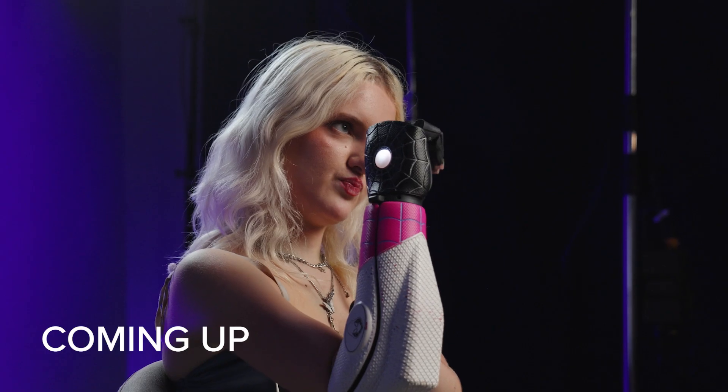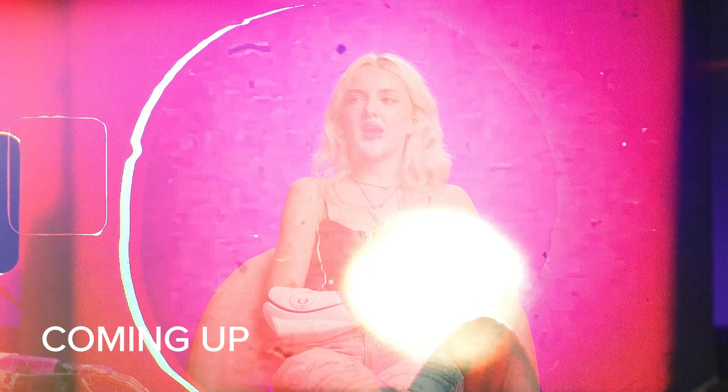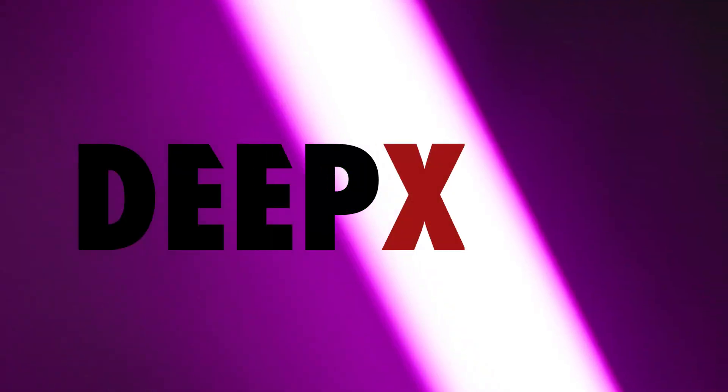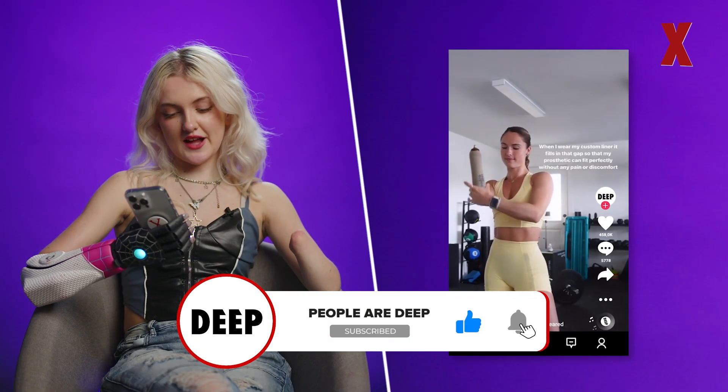If I squeeze my muscles it will close — this process is very very familiar to me. I was able to do a full makeup look using just one bionic arm. Hey, I'm Tilly and I'm gonna be watching some bionic arm prosthetic videos.